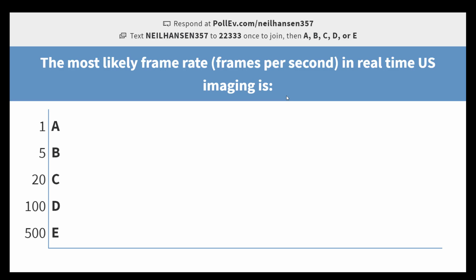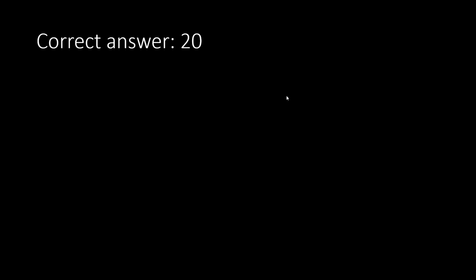This is time to wake up! Wake up! This is a check, because I said this a couple minutes ago. The most likely frame rate in real-time ultrasound, the correct answer is 20. 20 to 30 is pretty commonly employed.